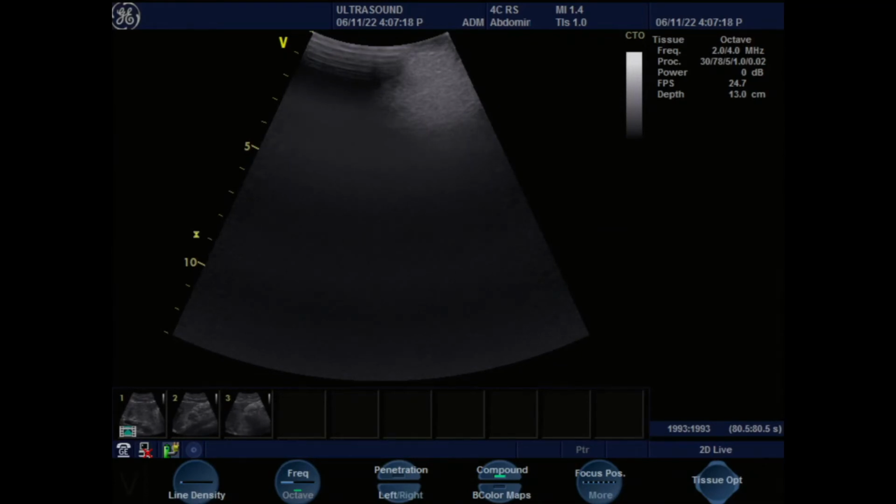The butterfly is much lighter, but the problem is it's not going to project, and I would rather we project so everyone can see, because otherwise we're not going to be able to see anything. So I would say we stick with this. I want to get people hands-on. If you want to do this, we can do it separately. We have another 20 minutes or so, and I want everyone to get 5 minutes to at least get the final views.